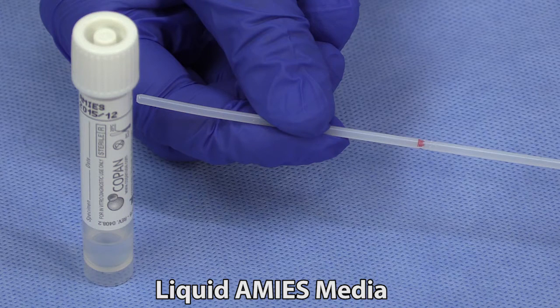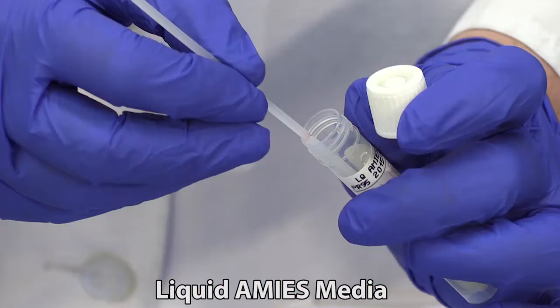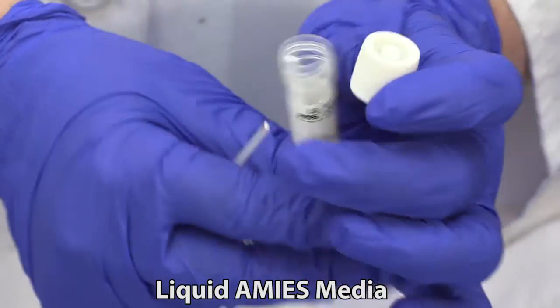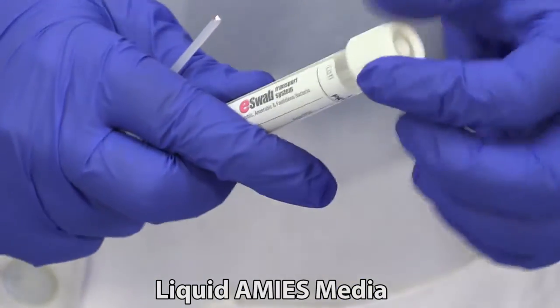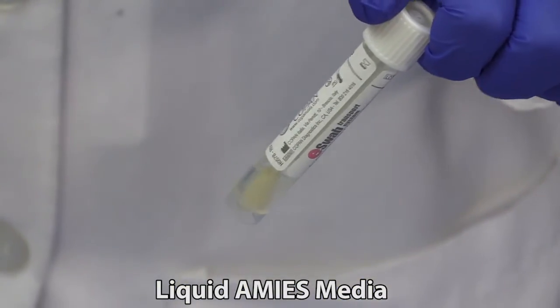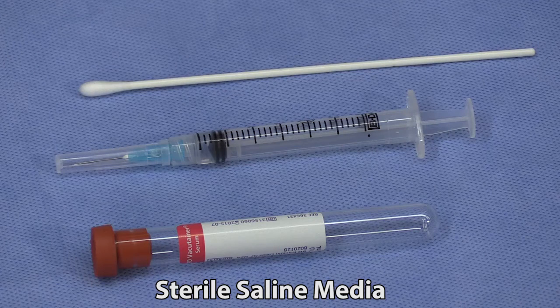Swabs in liquid Amies media can be used for both PCR testing and bacterial cultures. The swab is used to streak plates for culture and the liquid media is used for PCR testing. This has become the media of choice in our laboratory.